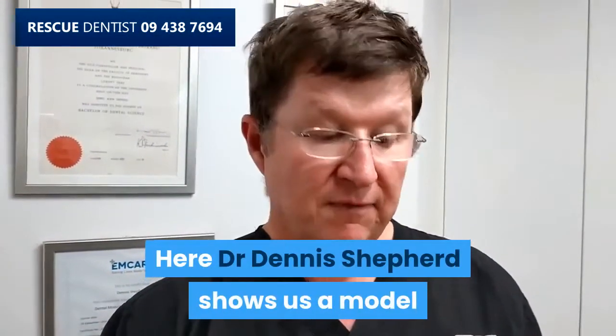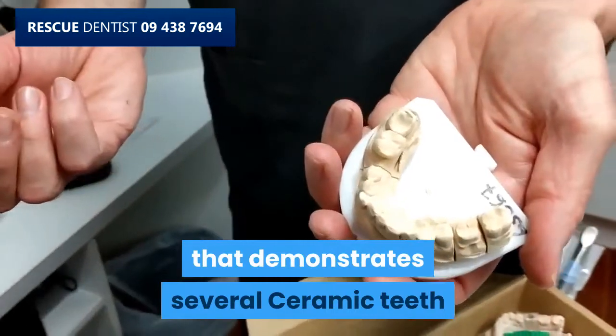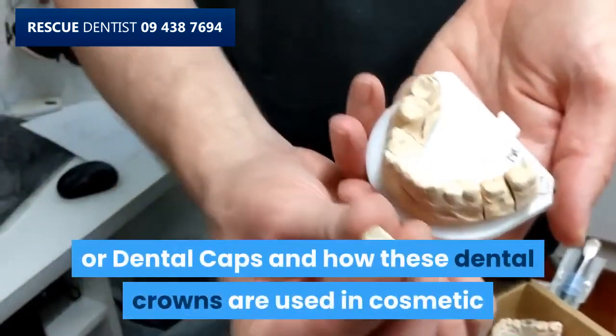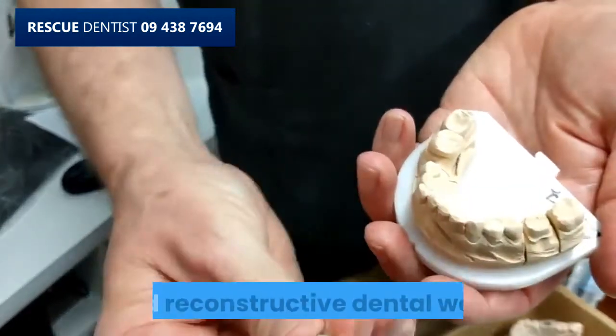Here Dr. Dennis Shepard shows us a model that demonstrates several ceramic teeth or dental caps and how these dental crowns are used in reconstructive dental work.